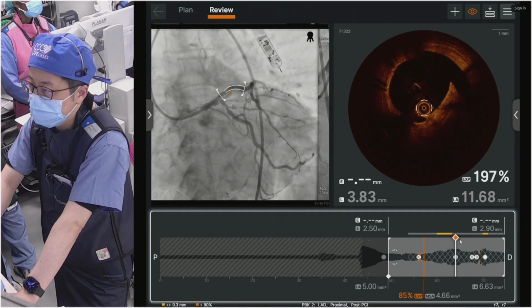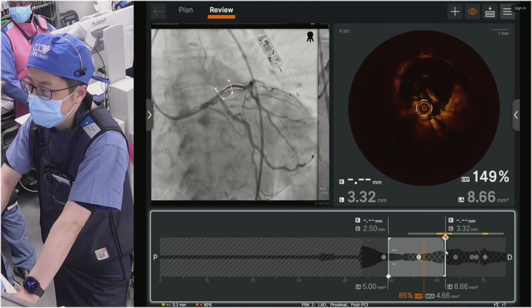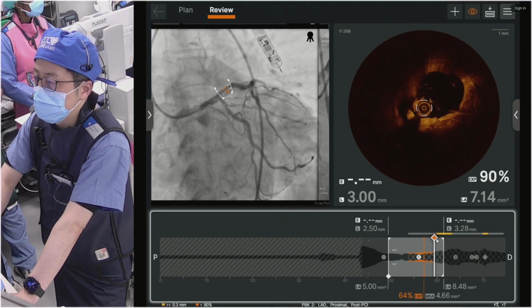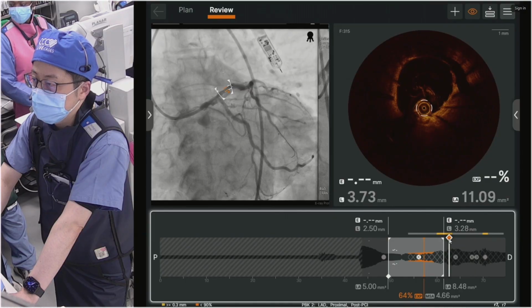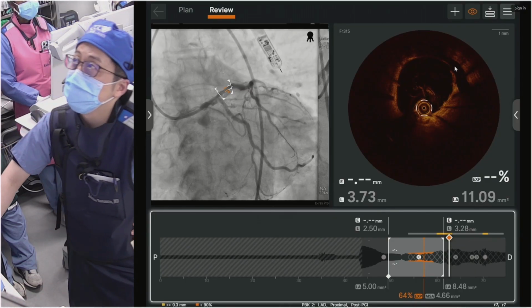It's kind of interesting. Bleeding into the plaque. Looks like a plaque hematoma. This here is rather interesting. Do you see anything? Yeah, like an intramural hematoma. A big dissection, intramural, an evolving dissection into a hematoma, and another lumen. Deep dissection, right?